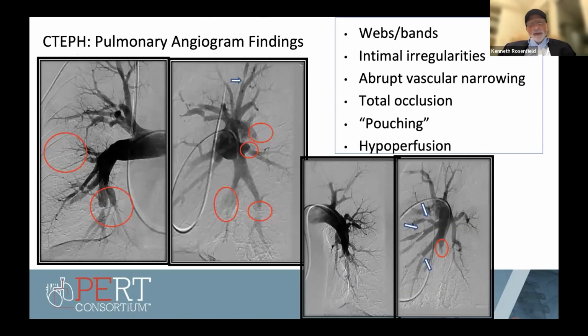And you've got to do the injections right. These are good injections right here. I'm going to tell you, I see so many crappy injections. You've got to learn as part of your BPA program how to do the right kind of injections. And we can talk about that.